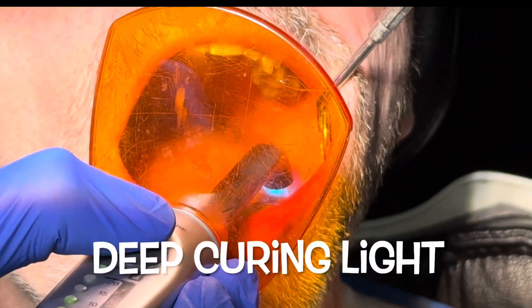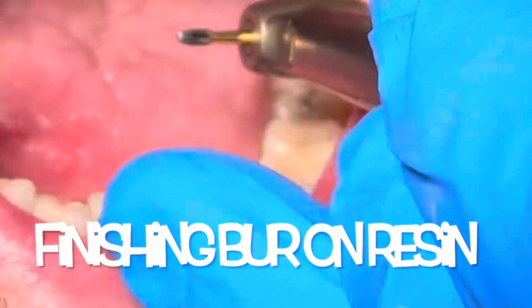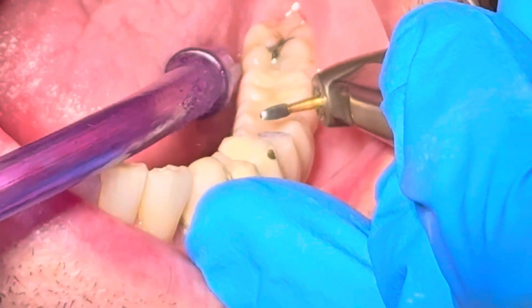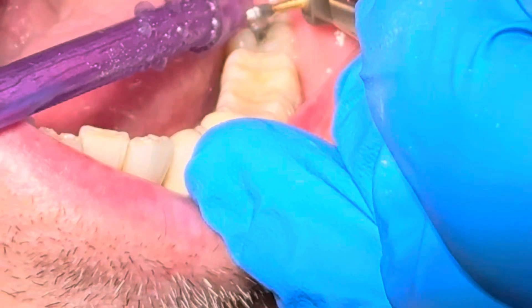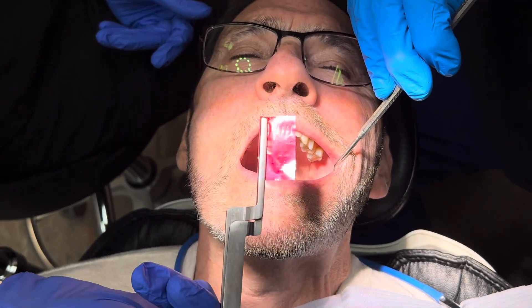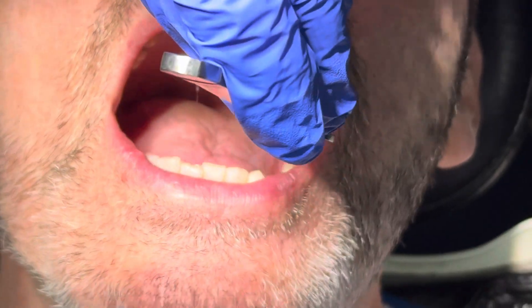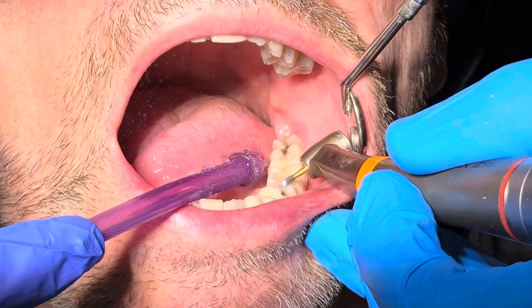I like to use a deep curing light to cure the resin — do it a few times to make sure it's fully cured. Then I come back to finish the resin with a finishing bur and convert to a red-striped diamond. We use two-sided articulating paper to check centric occlusion before doing lateral occlusion — the centric stops need to be verified with some coronoplasty.